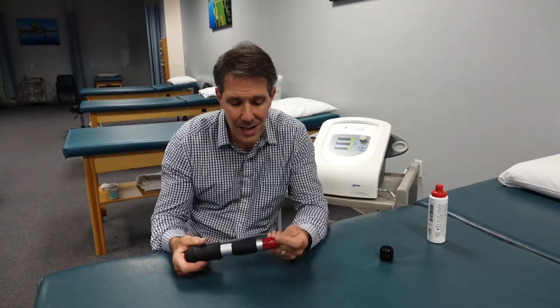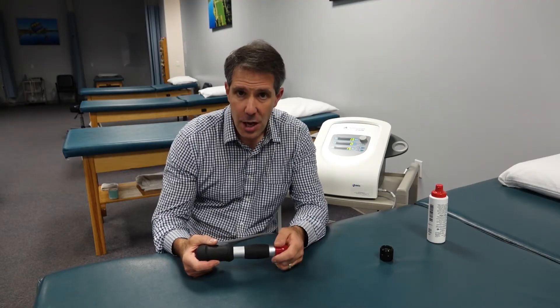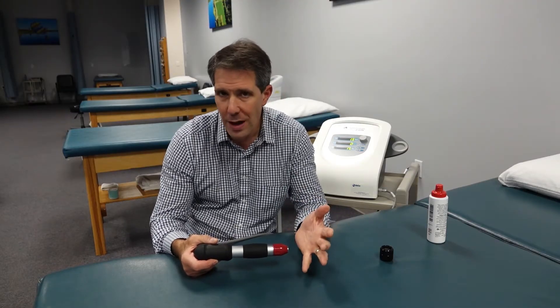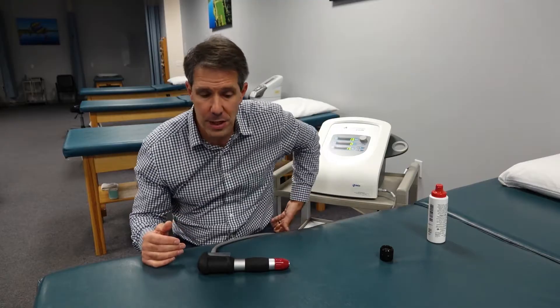It has a very great therapeutic aspect where we can increase blood flow to the tissues and we can increase the elasticity of the tissues. This works really well in chronic situations where you may have somebody who has an adhesive capsulitis or a piriformis syndrome.